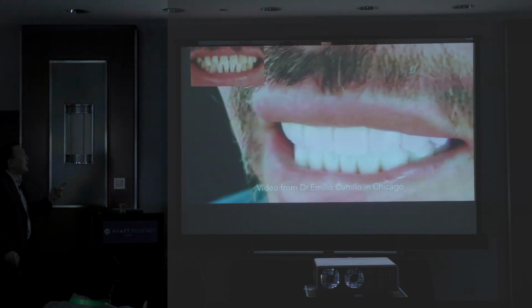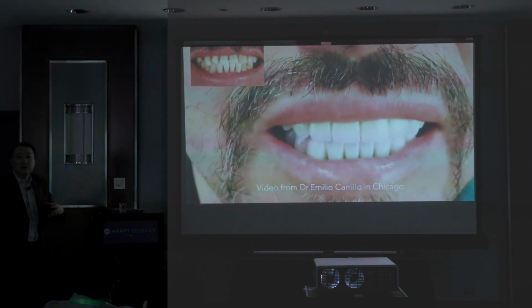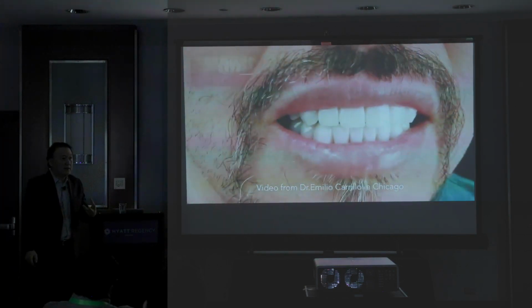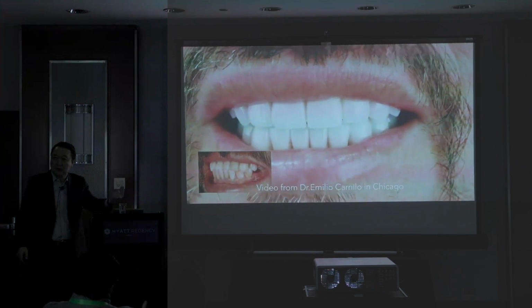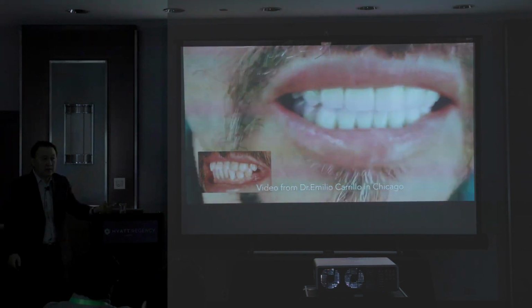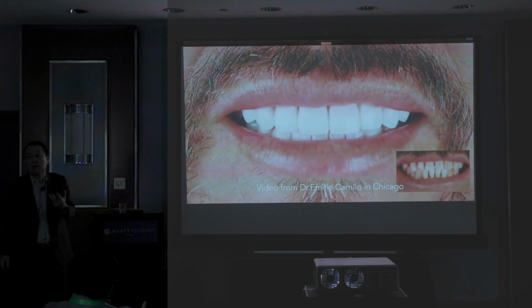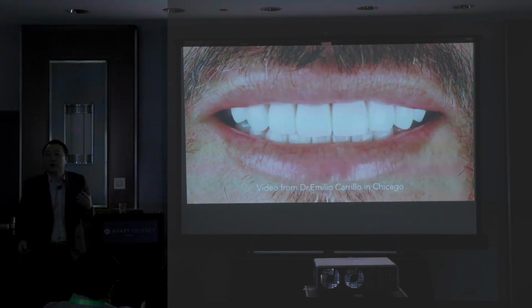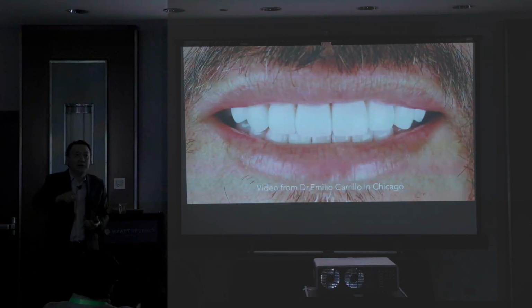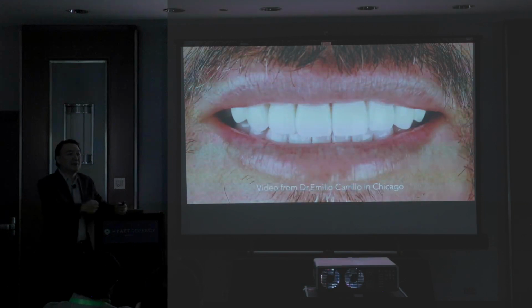So we set up not only the broken teeth but the contour, so it's all about the value, right? And then you have to utilize the zirconia block color, and also the strength, right? If I have a full mouth case, I always use the live one because I do have a lot of ridiculous cases. Sometimes they push the limit. Make sense to you? They push the limit all the way to the cliff.